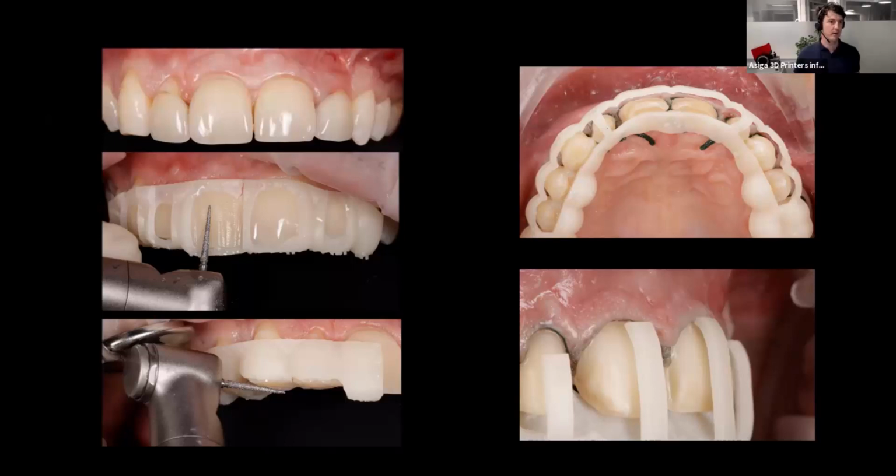Yeah, great. And so with a typical case of all these guides, do you just throw them all onto a single build? So you can get them all through and out in how long would it typically take to print something like that? It would be under an hour, would it? Something like that? Oh, the girls have got it down pat, like 45 minutes.